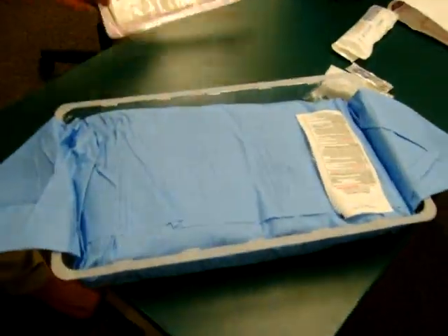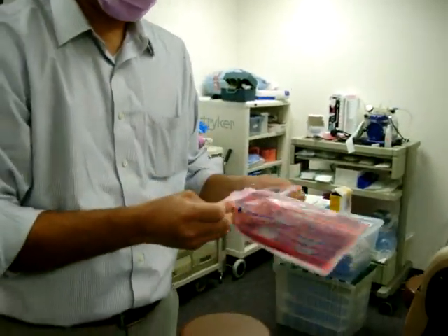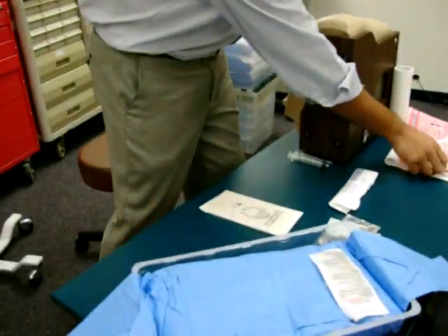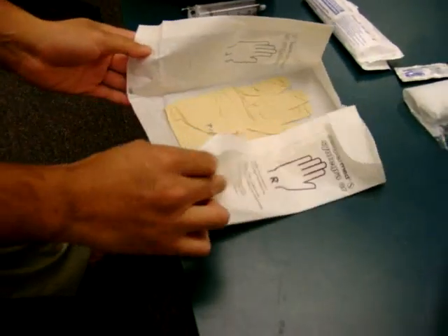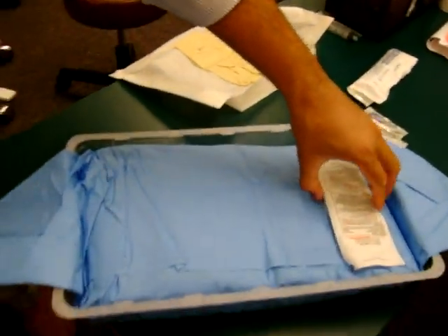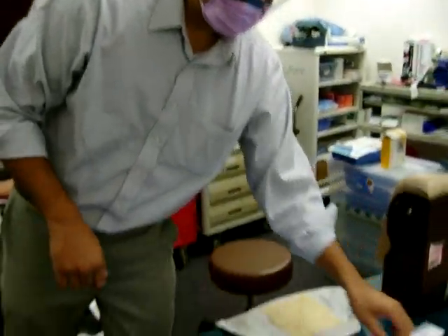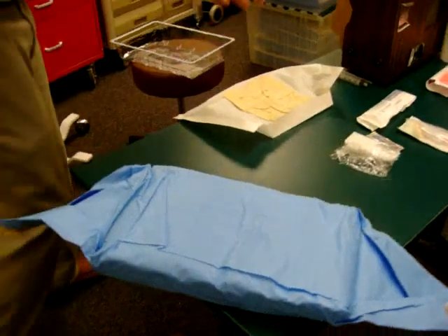Now that you have those things set up, you can go ahead and start to prepare your field. The next thing I do is open up my sterile gloves. You want to make sure — and this is the tough part because sometimes these little paper flaps pop back over — but you want to open it out nice and big and pop the ends out so it stays nice and open for you. You also have another chlorhexidine wipe which you'll use in a moment. Go ahead and get your kit ready — you want to open up your kit in a place where you have a little bit more space.